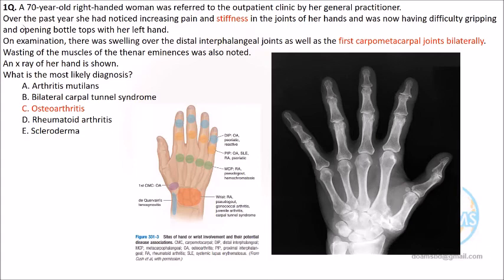The patient is also complaining there, an elderly patient. And there is no significant stiffness. Stiffness is there sometimes, but not long lasting. Usually in inflammatory disease, stiffness will be more than 1 hour. So the clinical picture as well as radiology. And if possible, better if you can remember the picture also, doctor.